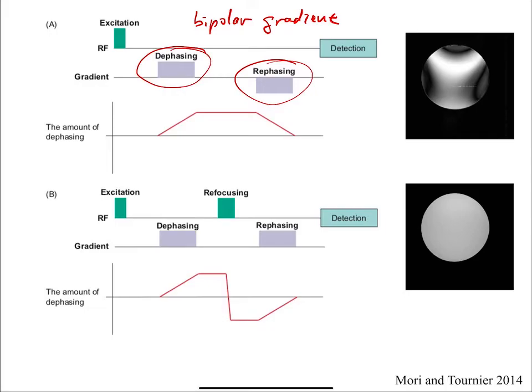Now, what we talked about in either the first or second lecture is that if you just do a scan like that, because there are a lot of other magnetic field inhomogeneities, this is what's called a gradient echo image, right? You're going to end up with dropouts in your signal. When you do fMRI, for example, oftentimes you'll see dropouts in the signal towards the front of the brain. In diffusion imaging, it turns out we don't need that T2 star contrast, right? We're not trying to measure T2 star.